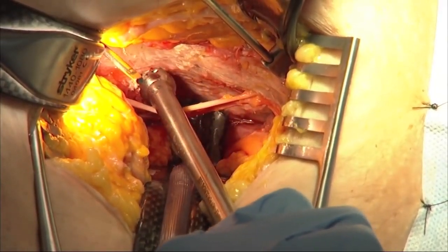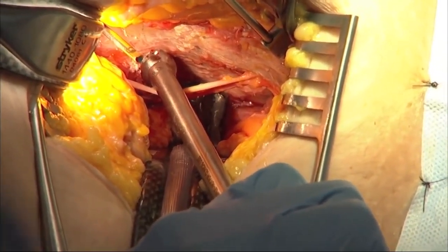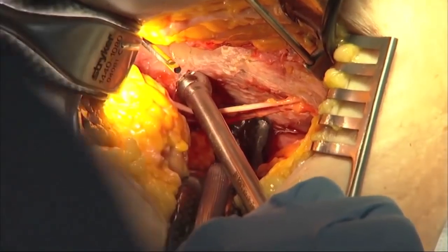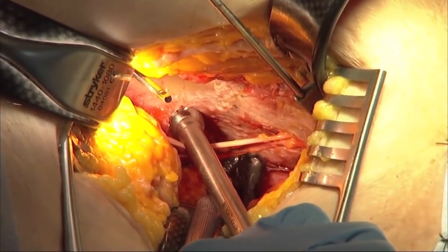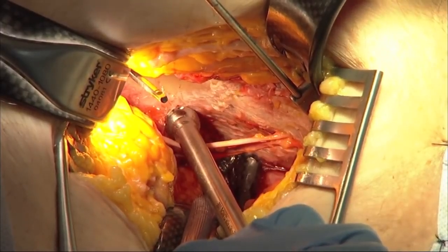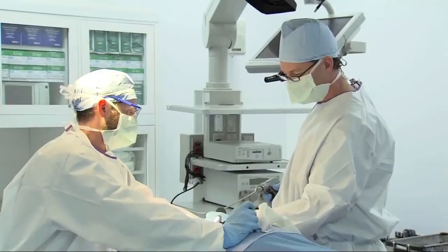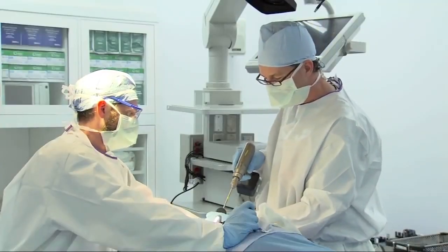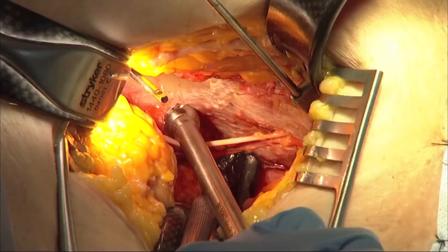The reason that's nice is that we're frequently trying to balance the screw on the end of the screwdriver. We'll drop the screw right into the wound. And this allows us to put the screw into the screw inserter and then follow with the screwdriver and place the screw nicely into the hole without having injured any of the vessels like that.